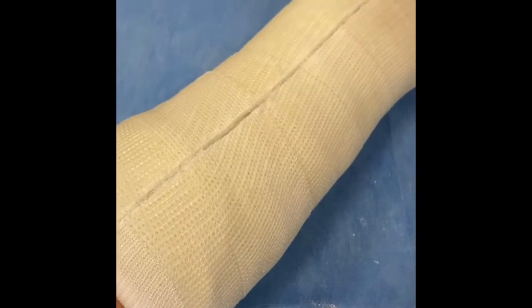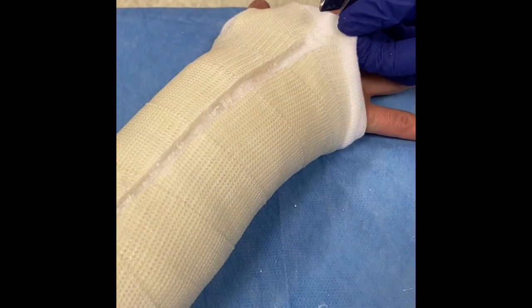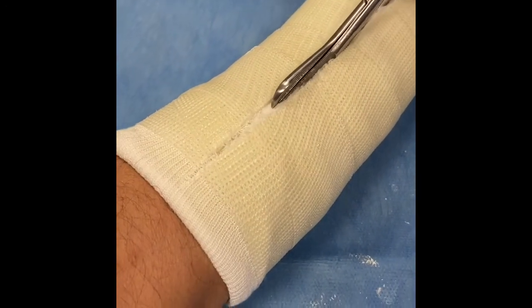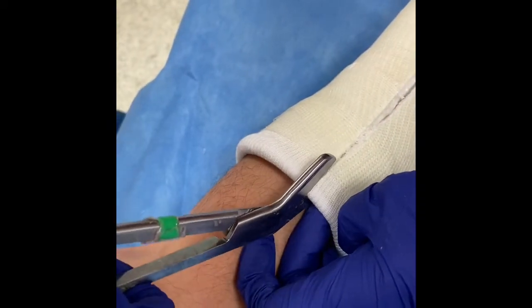Once the cast has been split up both sides, spreaders are used to break any final adhesions before the plaster scissors can be worked gently up the padding, releasing the cast completely. The patient is now free to start the rehabilitation phase of their treatment.